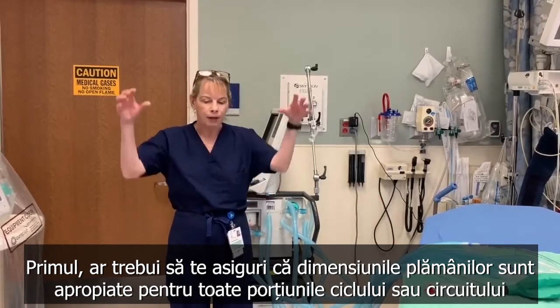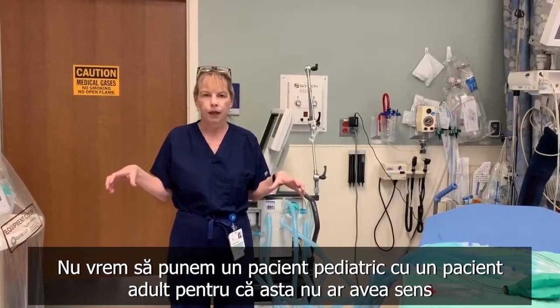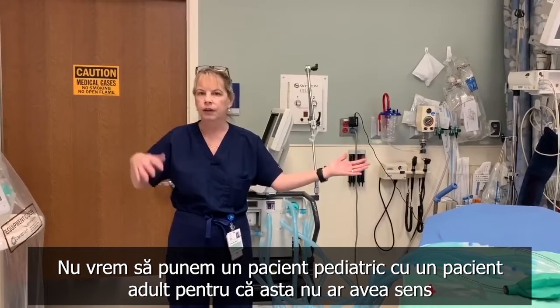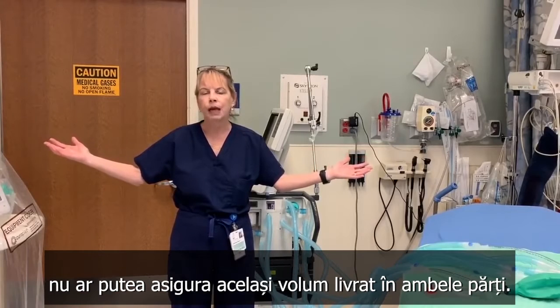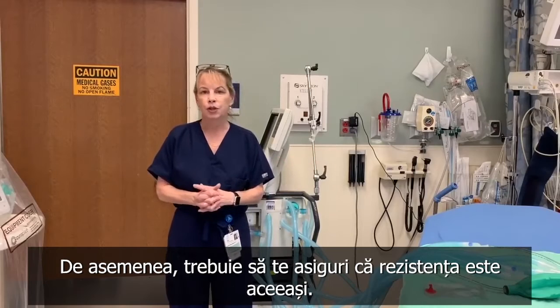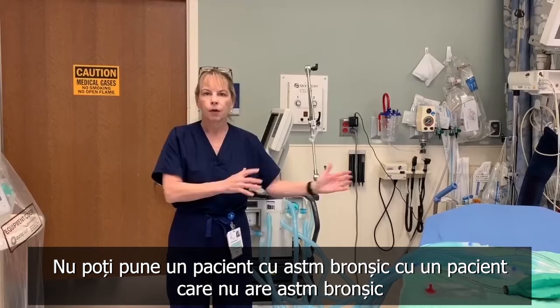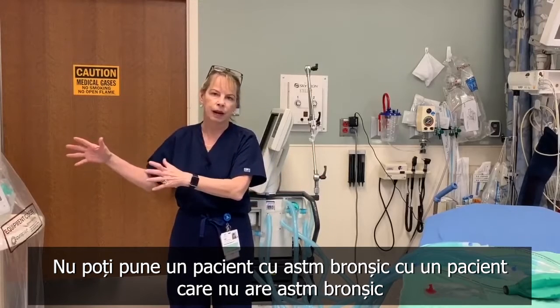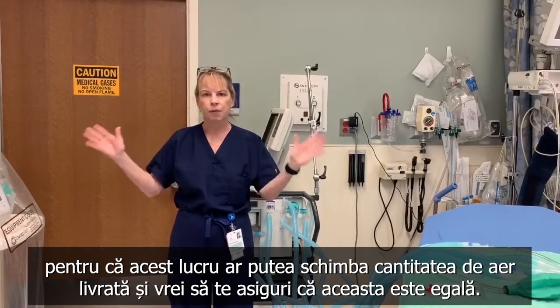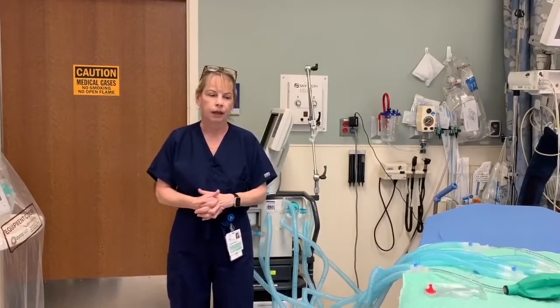First of all, you want to make sure the lung sizes are the same in all 4 portions of the cycle or the circuit. You wouldn't want to put a pediatric patient with an adult patient, because that wouldn't make sense. It wouldn't be able to ensure that the same volume is delivered everywhere appropriately. Likewise, you want to make sure the resistance is the same. You wouldn't want to put a patient with severe bronchospasm with a patient who did not have bronchospasm, because that might change the amount of volumes and it wouldn't make sure that they were equal volumes delivered to everybody.